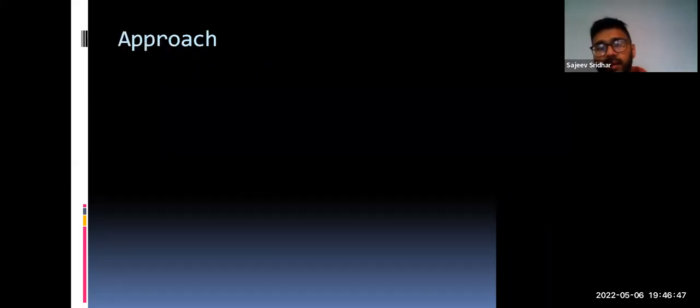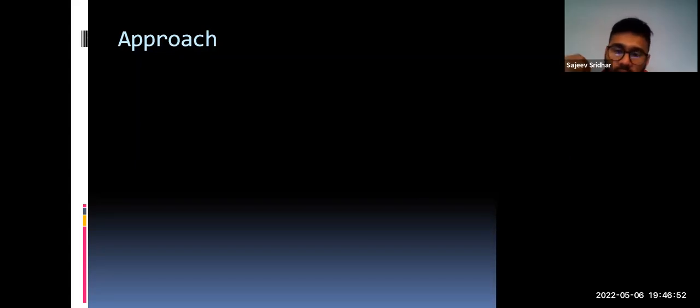Approach. Excellent. So the next thing that I want to talk about is the approach itself. Now, here's basically how to actually view the CT without missing any of the important signs. It's very, very easy to miss important parts on a CT. The reason why is because it is a lot of information to take in.